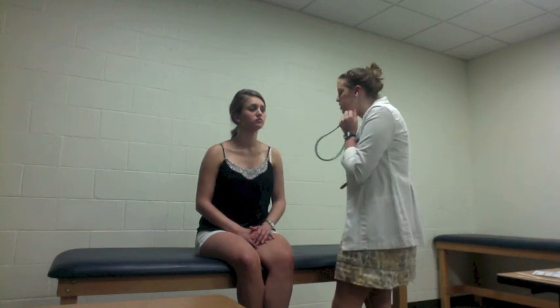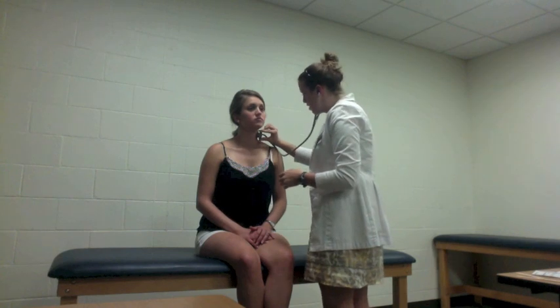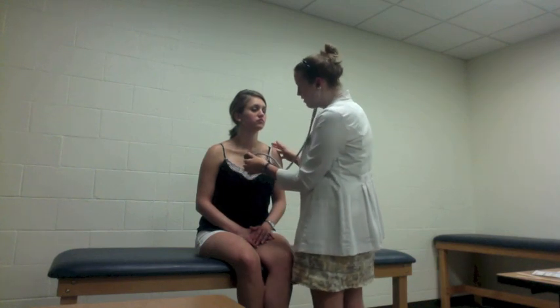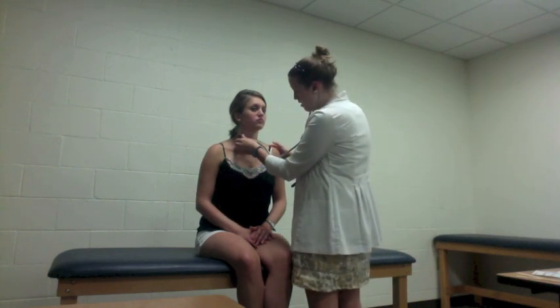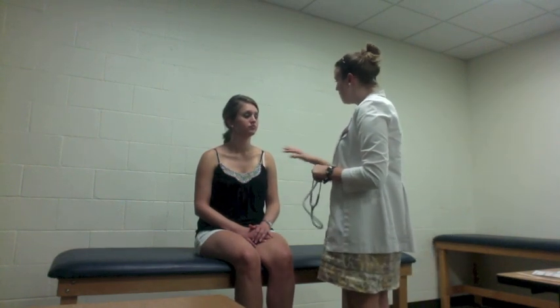What I'm going to have you do is take a deep breath and hold it. Perfect, you can breathe. Now take a deep breath and hold it again. I didn't hear any bruits, which would indicate turbulent blood flow, and it sounds normal. So now I'm going to listen to your lung sounds.